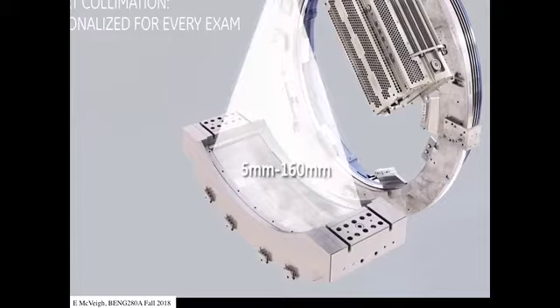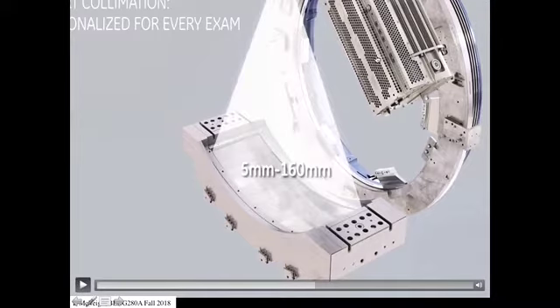If you use energies that are low, all of those X-rays get stopped, right? And all you get is an outline of the person. You don't see anything inside, right? If you use an energy that's too high, virtually all of the X-rays go through, and so you don't really see much contrast. And so you have to hit that sweet spot where the X-rays sort of get stopped on the order of 50%.